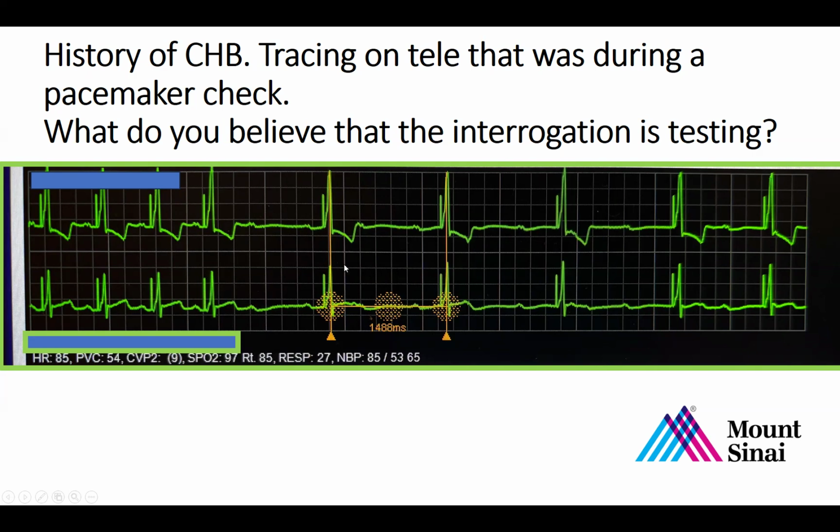I actually tested this particular patient's pacemaker after arrival from the ICU, and I also was unable to check the R wave in this patient. If you look at my note on the patient, which we can go over at another time, I do not actually comment on the R wave because the intrinsic rate was too low. The patient's heart block was pretty deep.